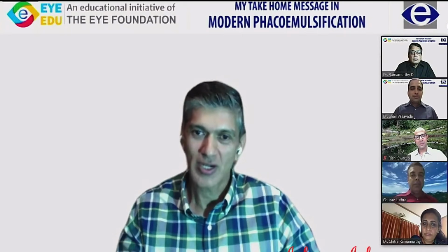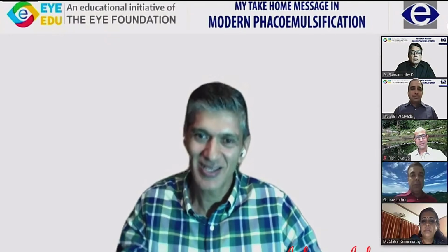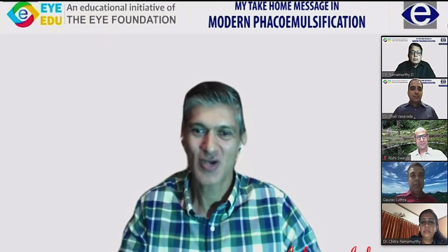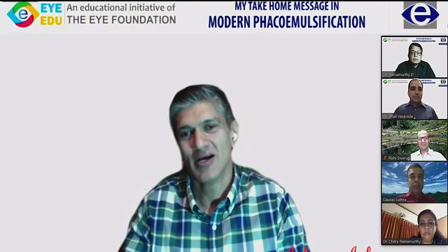So you have to kind of punch it. If you don't punch it, then it doesn't really enter, and then they are struggling to push it. You can't really push it. You have to punch through. That is one point I just wanted to emphasize.